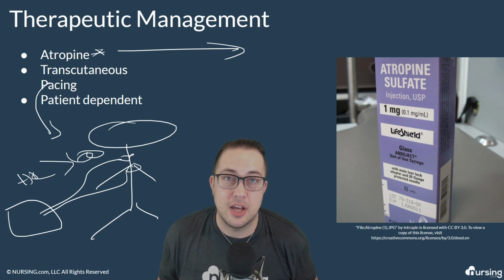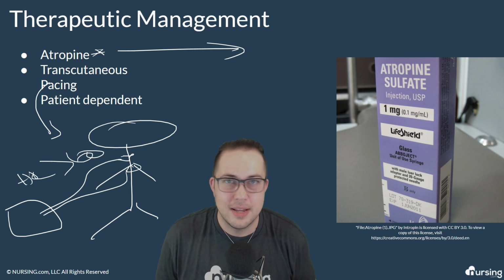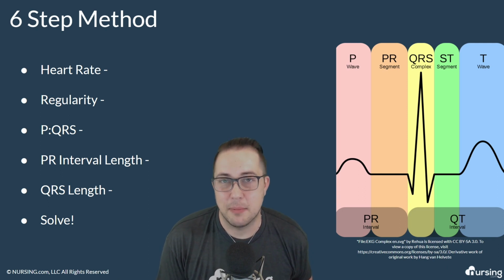Again, the overall idea of these treatment modalities is we need to increase the heart rate. And as usual, with everything, it's patient dependent. And so now we get to the point where we need to try and learn how to identify sinus bradycardia on a rhythm exam.